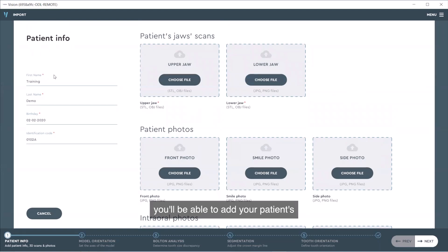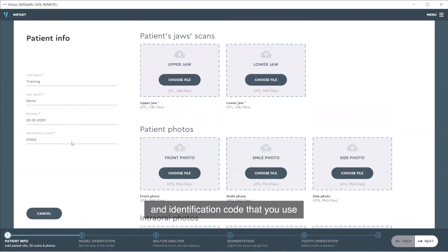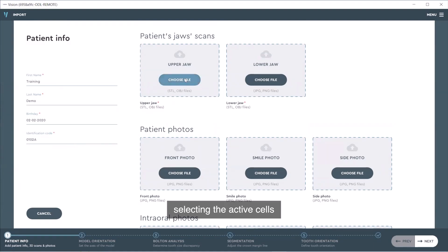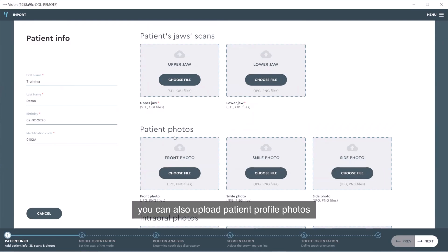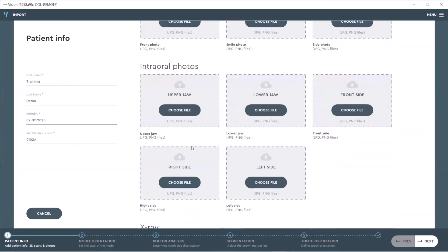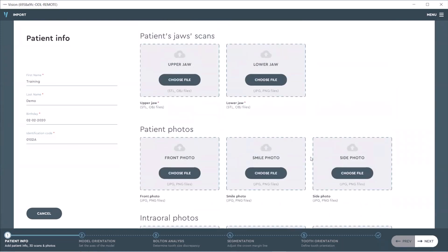In the patient information scene, you'll be able to add your patient's first name, last name, birth date, and identification code that you use for your cases. We will also be selecting the active cells to upload our upper jaw and lower jaws as STL or OBJ files. As an option, you can also upload patient profile photos, patient intraoral photos, or any panoramic or x-ray images, all as JPEGs and PNG files. These are not mandatory — the case can be uploaded without any of these images, if you choose.